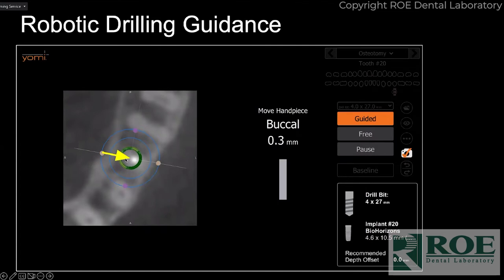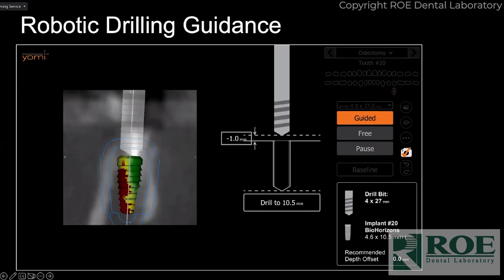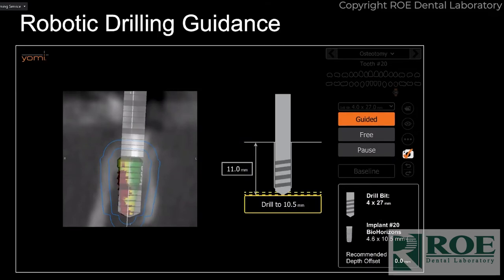It shows buccal and lingual presentation — I have all three images open on my screen at all times, so I'm looking at all of them simultaneously to ensure I'm where I'm supposed to be. All the data you need is there: offset if you need it for subcrestal placement, it tells you when to move the handpiece, where to go, and once you're in position it beeps at you. When you reach your planned depth — say 10.5mm — it stops and you cannot go further.